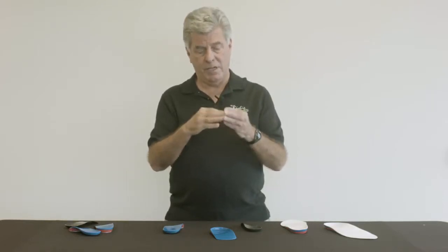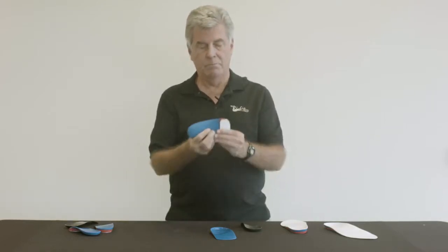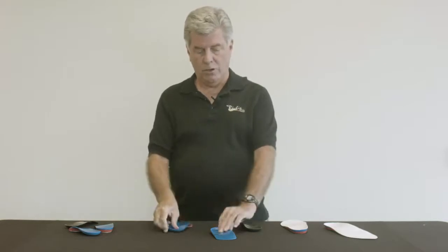Hi, I'm Dr. Doug Ritchie and today we're going to talk about posting custom functional foot orthoses. A common option on your prescription form is the addition of either a forefoot post or a rear foot post or both. I'd like to talk about the advantages and even the pitfalls of ordering posting on custom foot orthoses.